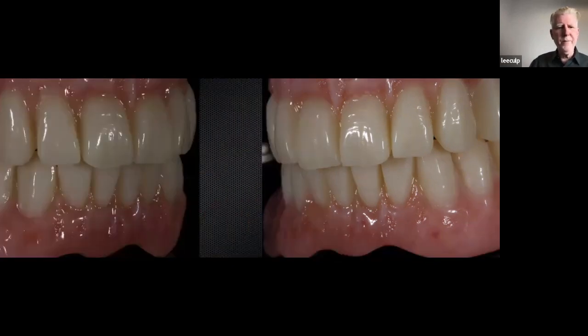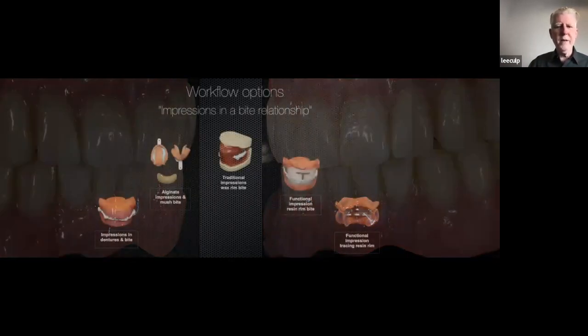So again, same thing, milled bases, milled bridged teeth, but then I did add composites on top of the milled base using the connect. And again, just to get different colors, to get those tissue colors, to make it just a little more natural looking than just the one base color.